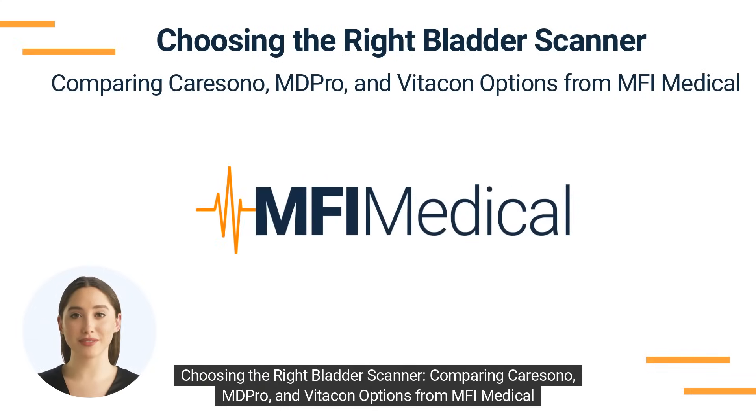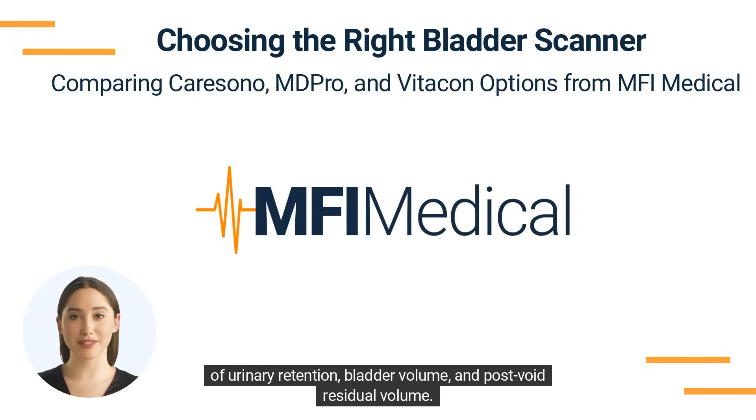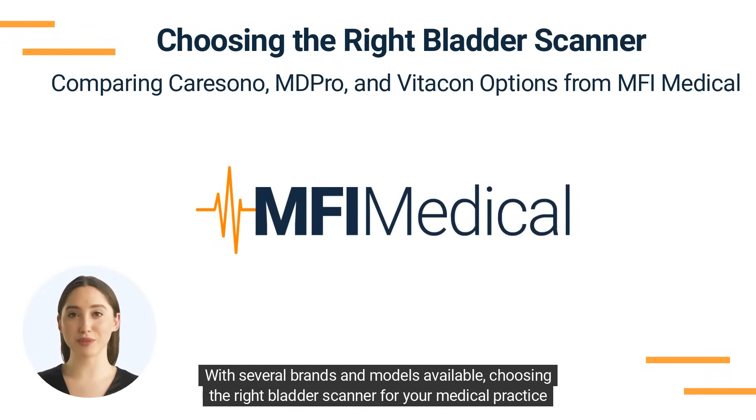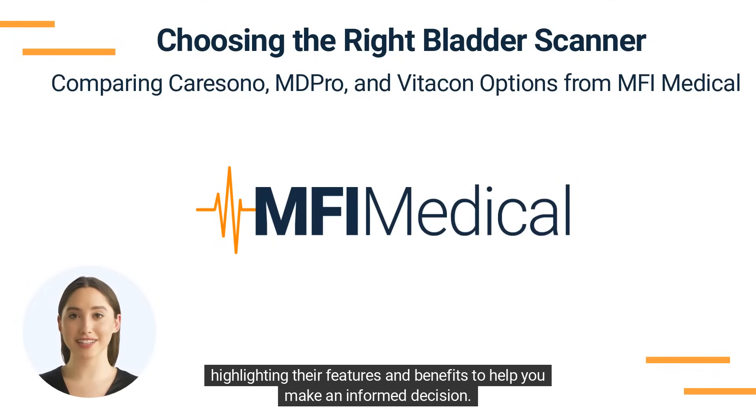Choosing the right bladder scanner: comparing CareSono, MD Pro, and VitaCon options from MFI Medical. Bladder scanners are crucial diagnostic tools for healthcare professionals, assisting in the assessment of urinary retention, bladder volume, and post-void residual volume. With several brands and models available, choosing the right bladder scanner for your medical practice can be challenging. In this video, we will compare six popular CareSono, MD Pro, and VitaCon models available at MFI Medical, highlighting their features and benefits to help you make an informed decision.